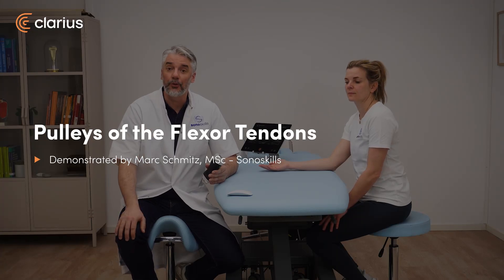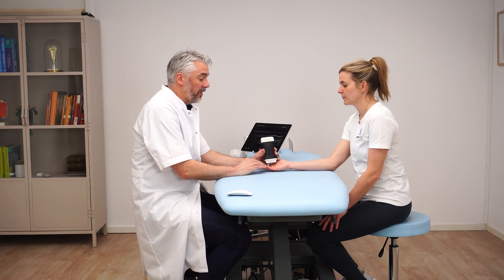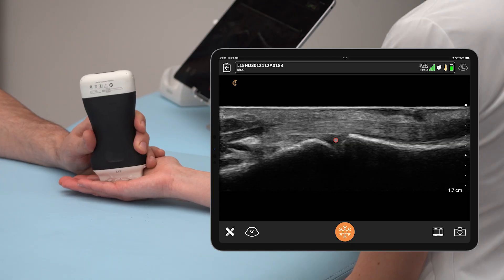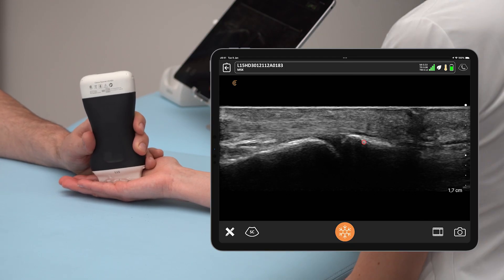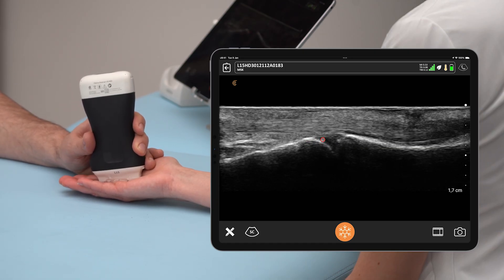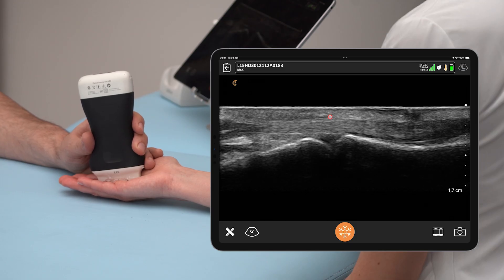The pulley system of the flexors can also be scanned. The patient's hand is placed on the table on the dorsum of the hand, and we start by scanning the MCP joint, which can be seen right here. We can see the proximal phalanx, the metacarpal head, the volar plate within the joint, and the flexor tendon with the A1 pulley on top of it. The A1 pulley straps the tendon to the bone and provides tendon stability.